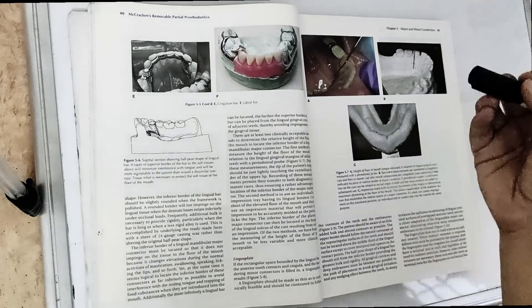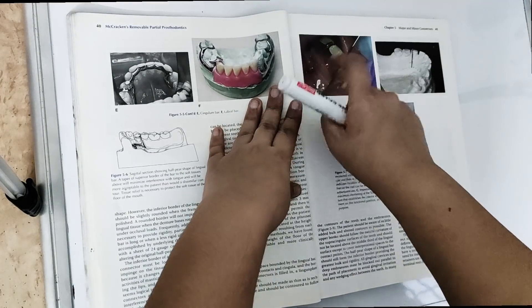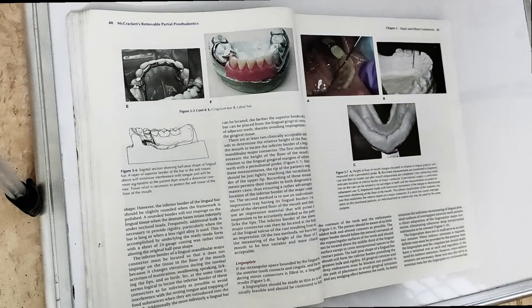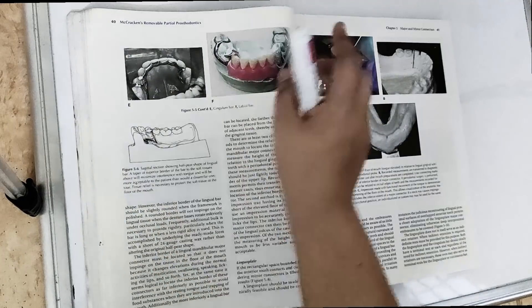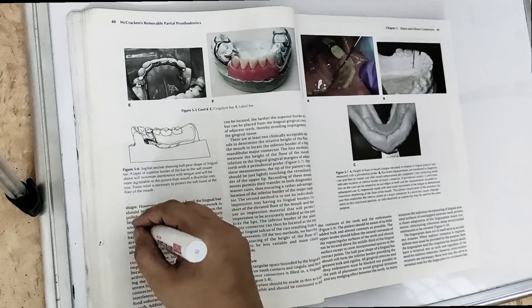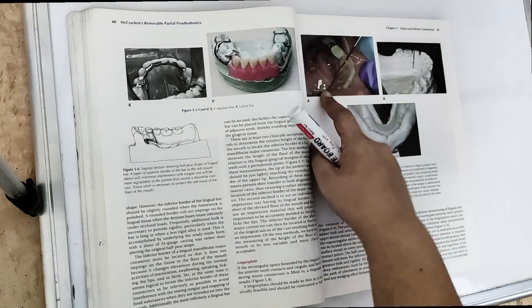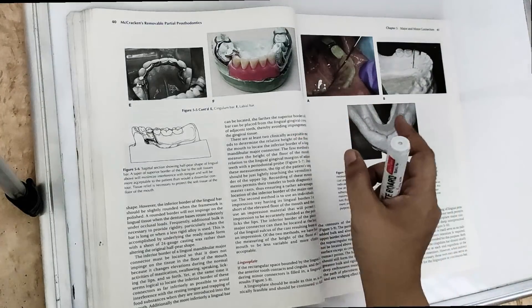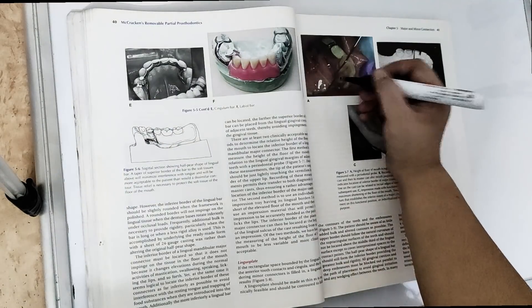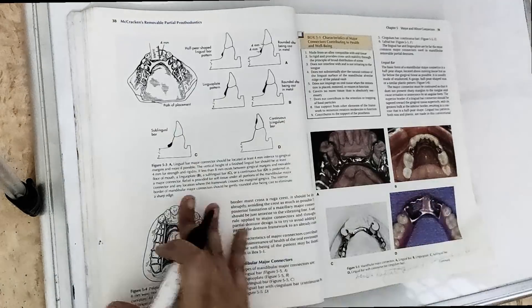To measure before placing the mandibular major connector, we take a periodontal probe and ask the patient to lift their tongue to touch the upper lip — the vermilion border. This lifts the tongue so we can insert the periodontal probe to check the height of the floor of the mouth, giving us the tissue relationship.